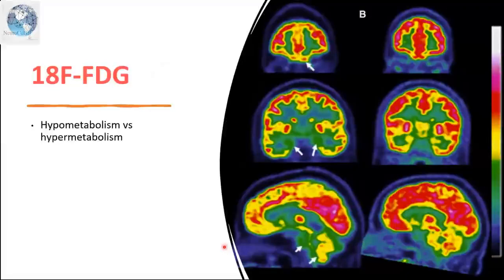So 18F-FDG, you know, our brain uses a lot of glucose. So if you inject a glucose analog, obviously everything's going to light up. So when do I know this is pathology or not pathology? It's very hard. Even Dr. Kamalia showed you a few FDG PETs. So you must be wondering how the doctor can differentiate this area as a problem, or this area as hyperactive or hypoactive.